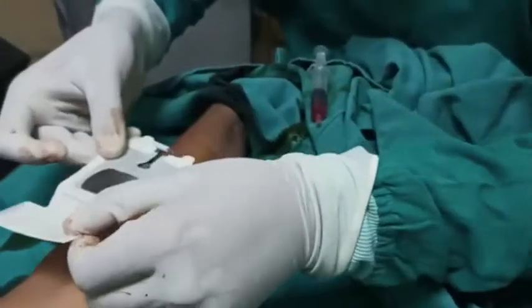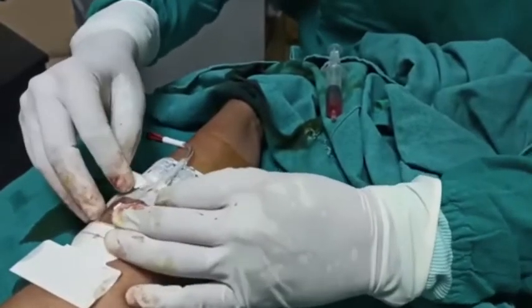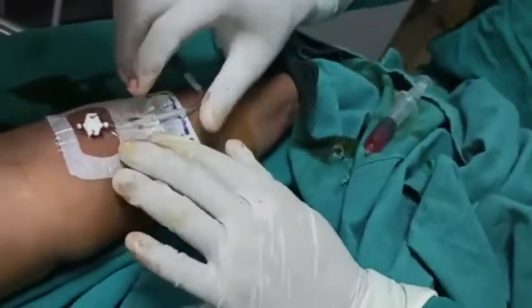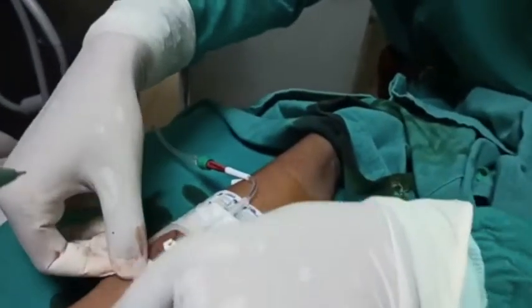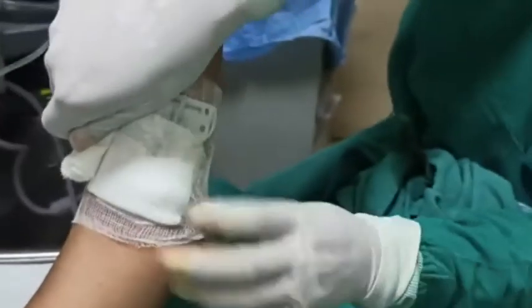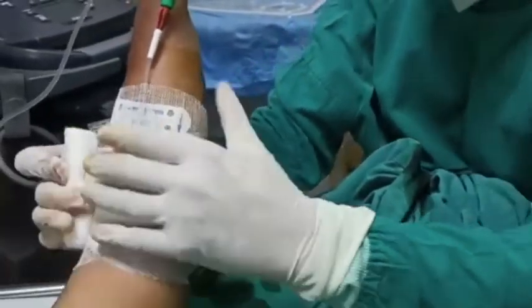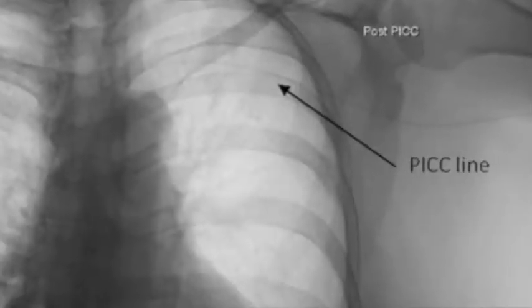Now we connect the fluid. We put the tagger derm over the puncture site. It should be transparent so that we are able to visualize any infection or allergic reaction, and then we do a pressure dressing for some time to prevent any issues with the PICC catheter.